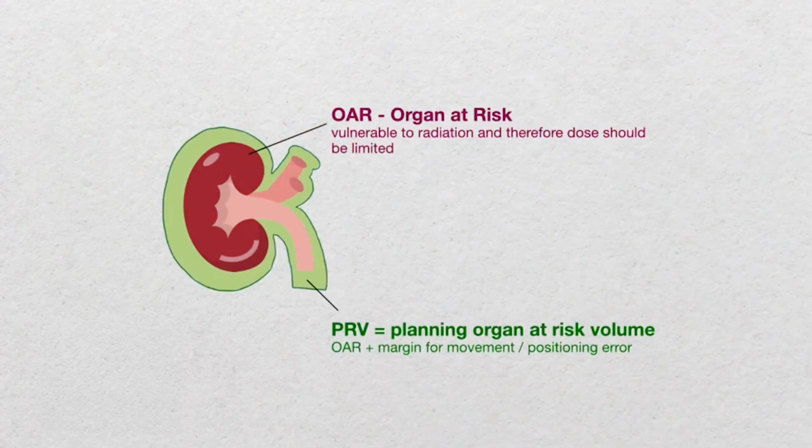When contouring a plan, you'll go through each of these volumes before passing it on to the physics team for planning. The references will be linked below.